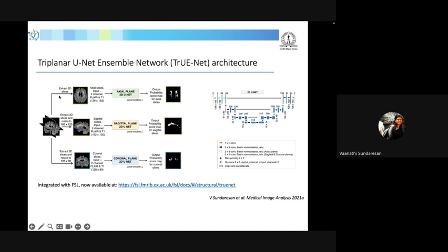Now coming to our actual architecture, we use this 2D UNet across the 3 dimensions of the image. So we have 3D MRI volumes, and we apply these UNets in all 3 directions or dimensions, however you want to call it.